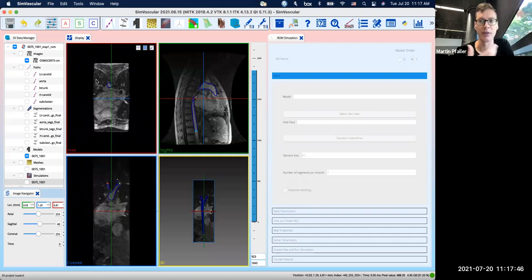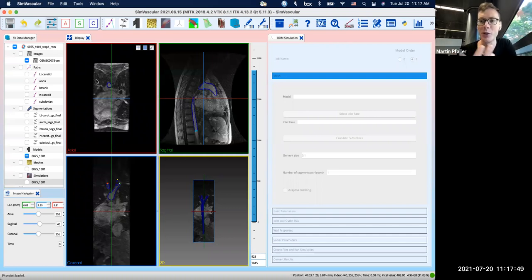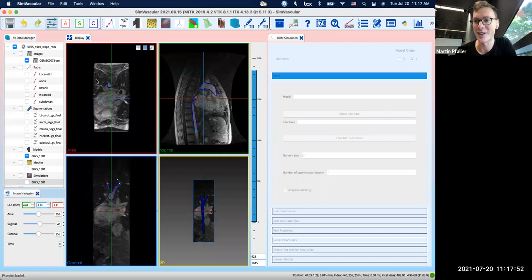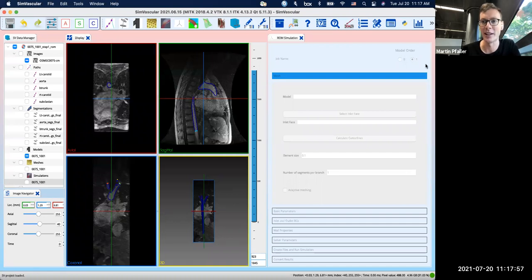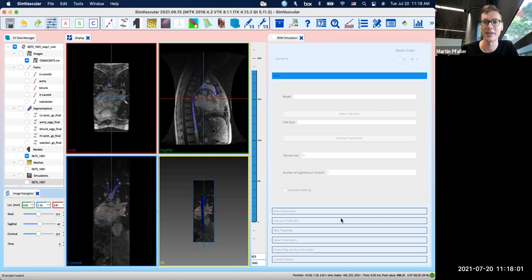For example, for boundary condition tuning, or if you want to perform some UQ, or just getting started with the model and trying to figure out how everything works. It could make a lot of sense to start the process with a 1D or 0D model because they're just that quick to compute.